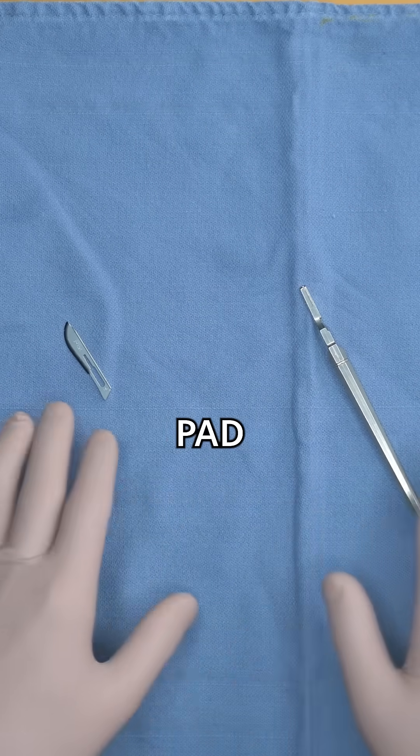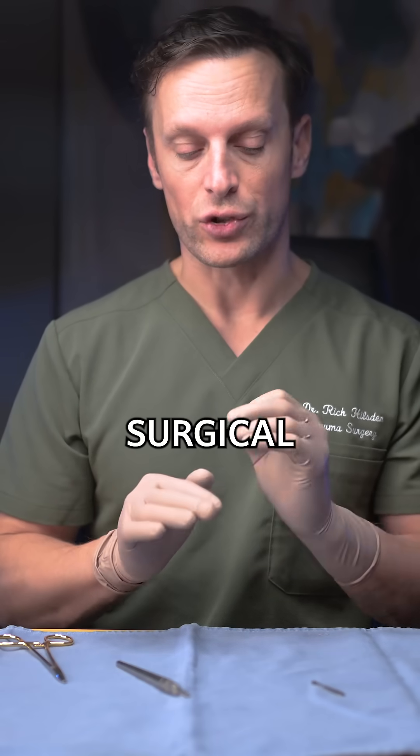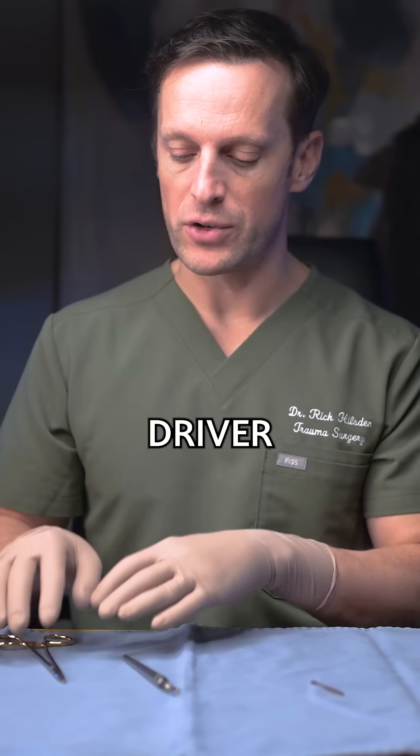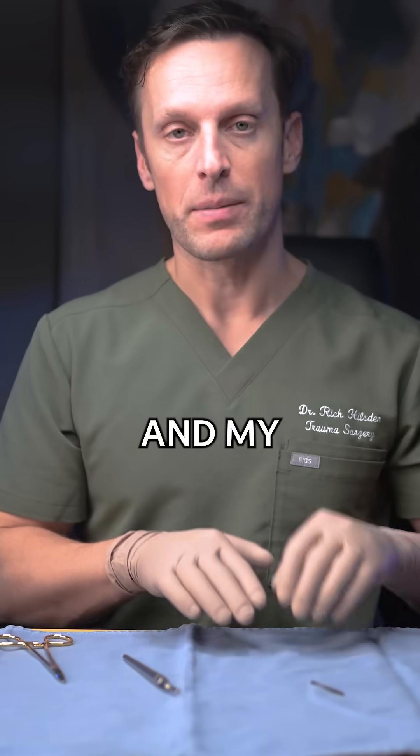How to load a scalpel. Here my blue pad represents a sterile surgical field. I've opened my scalpel handle sterilely, my driver sterilely, and my scalpel blade.